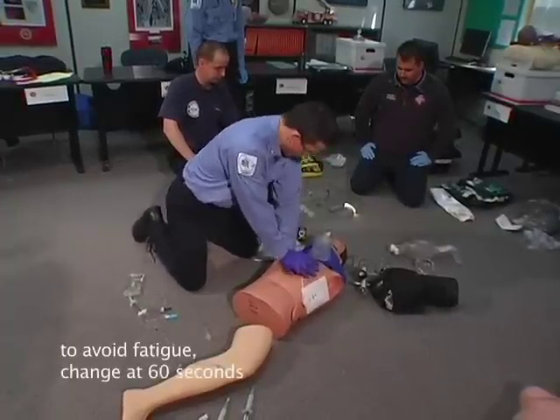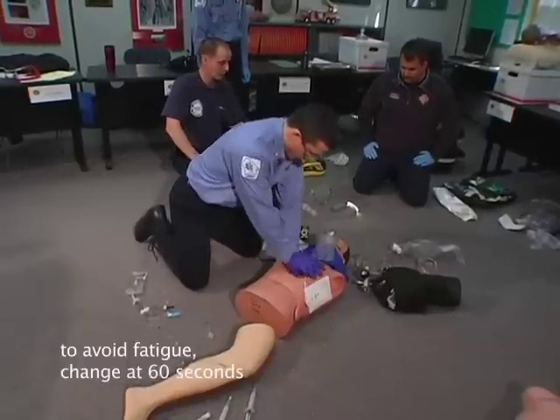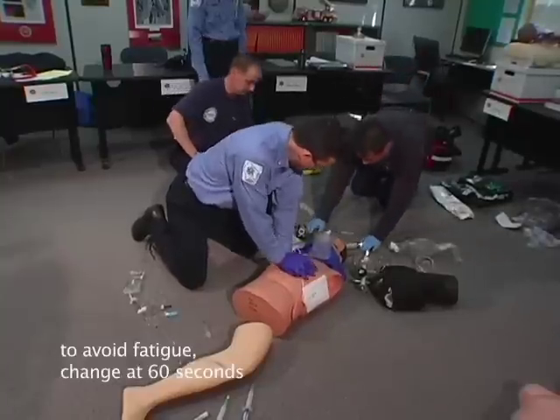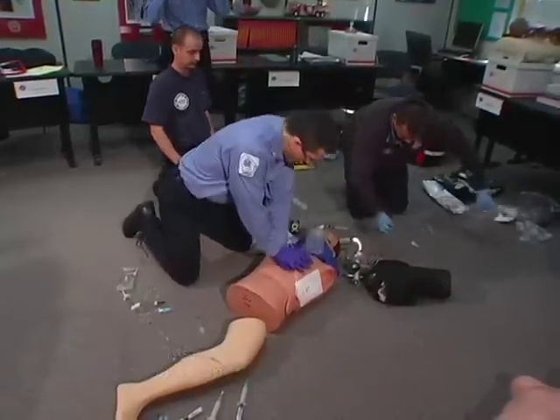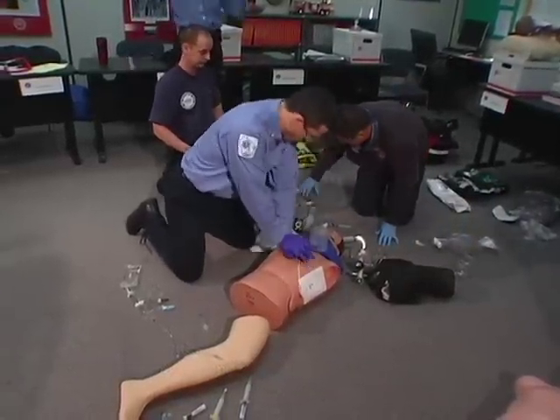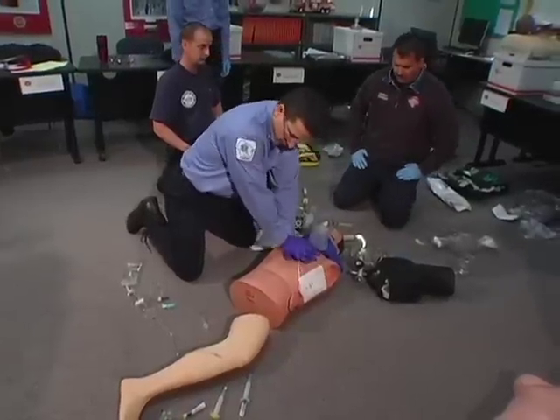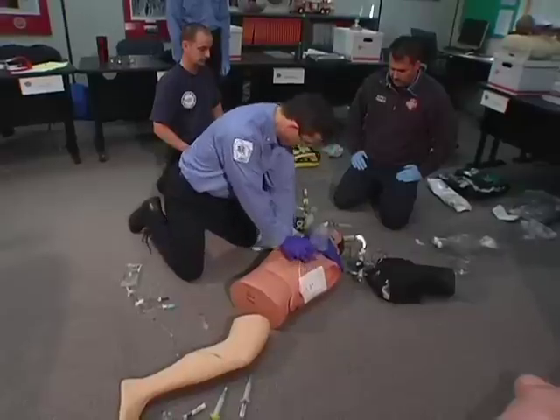After the third cycle is complete, after this next defibrillation, immediate airway. The concept of rapid sequence airway: one rapid look, no interruptions in chest compressions. If you have a target, intubate them. If you don't have a target, place a combi tube. It is acceptable to briefly hold chest compressions to make sure your placement is right, particularly if you intubate them. We've got to be sure we're in the right place.